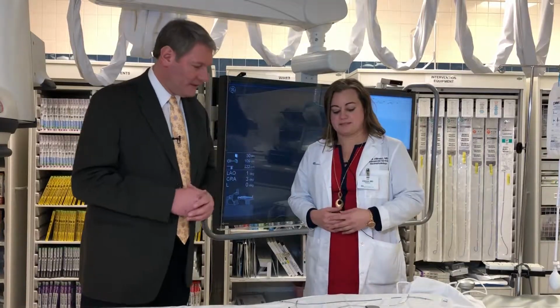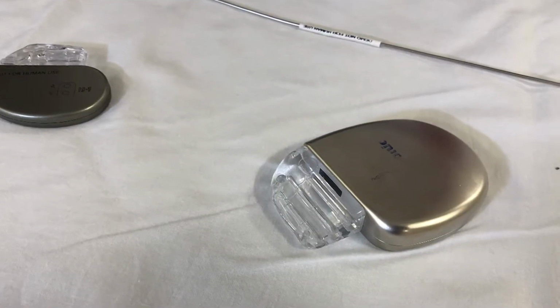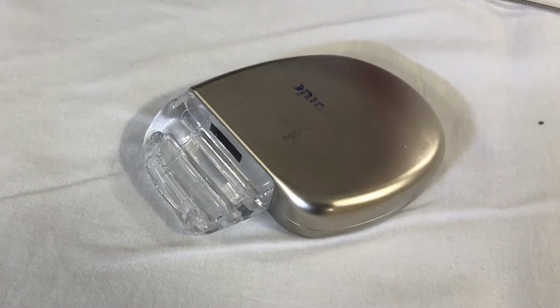Okay, what are some of the other devices we have to work with? So some of the other things that we have are defibrillators. So these are for the opposite of a pacemaker. This is when someone's heart is beating too fast in a dangerous rhythm from the bottom chamber of the heart. Essentially, some people have a weak heart muscle, and that heart muscle can contract abnormally, and that can make them predisposed to a dangerous fast heart rhythm that if left untreated, because the heart's not really beating, it's kind of just quivering. So the blood's not really moving, blood's not getting to the brain, and if not enough blood gets to the brain, a person could pass out or could even die.